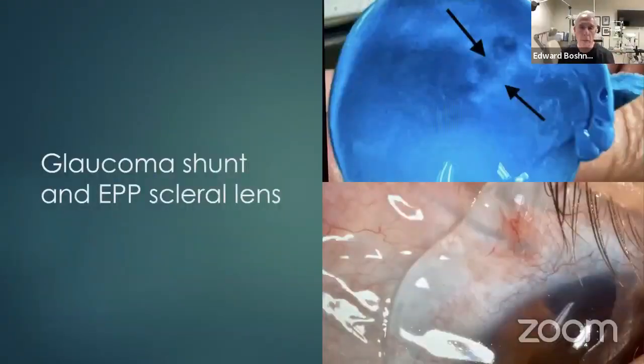Here's another patient with a glaucoma shunt. This time the shunt was around 11 o'clock, and you can see the outline of the shunt. But look at the eye print pro, the impression that we took. You can see the outline of the glaucoma shunt in the impression, and the resultant eye print pro scleral lens vaults over this patient's eye. This is the eye of an 11-year-old girl who had cataract surgery when she was under 3 years old, glaucoma surgery, and so forth when she was just under 3 or 4 years of age. And the patient's seeing very well with this lens.